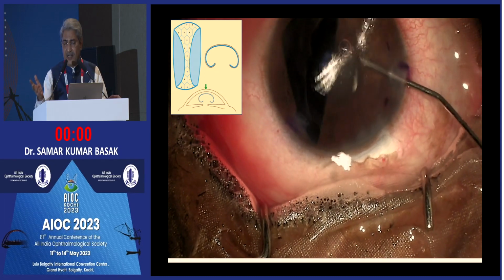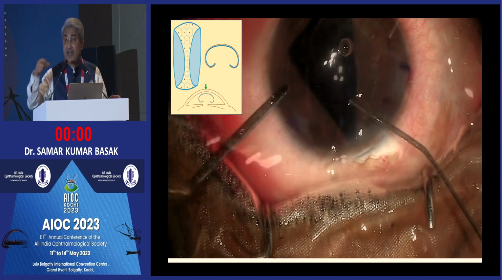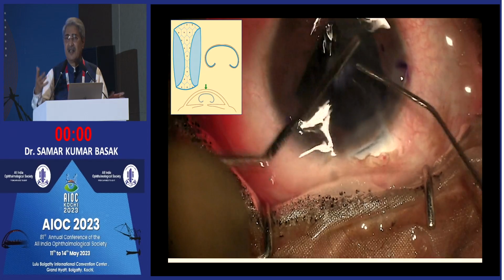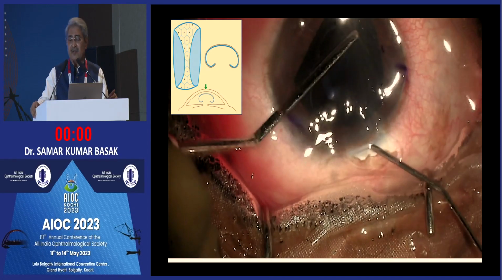When it flips easily, not in a short burst but a little, it is a controlled fluid, and when it is open, you see the typical hat sign, and now you open it.